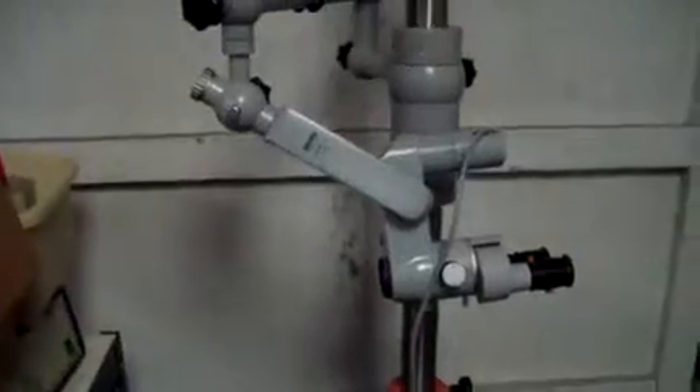Hey, it's DCSP Medical in the warehouse today looking at a Zeiss Opme 9 microscope. It's in nice cosmetic condition, obviously it's a little bit older. It's got the F125 binoculars with it.